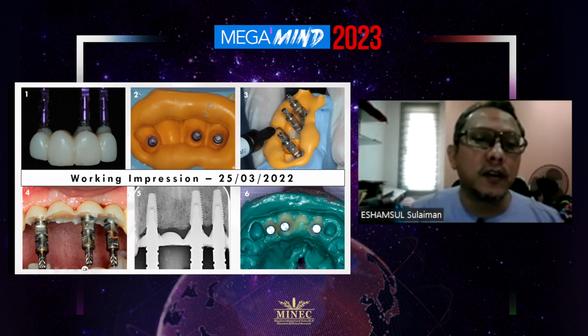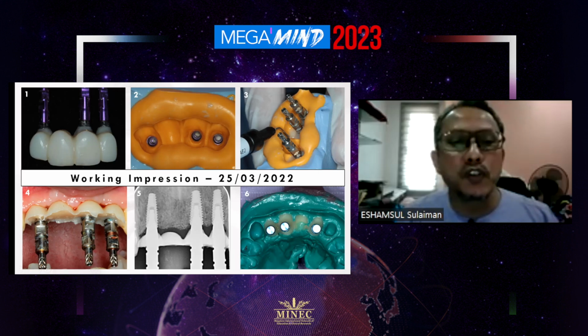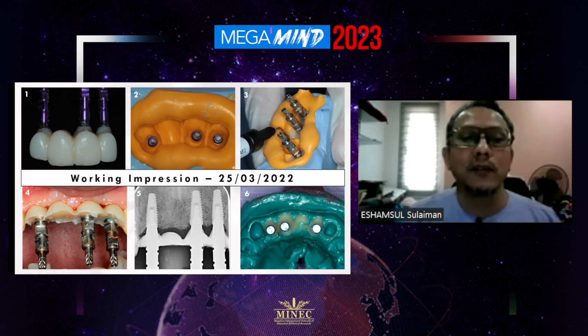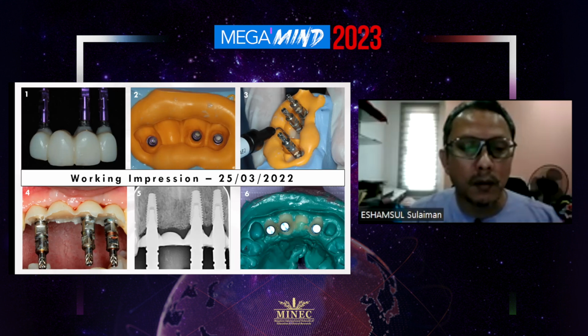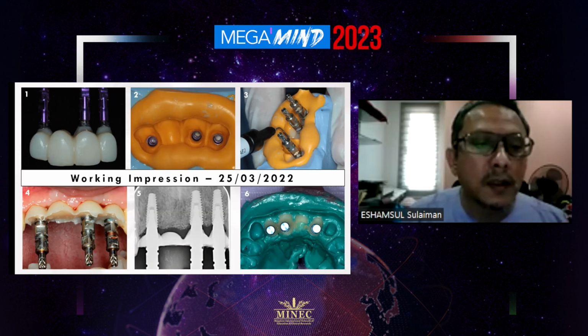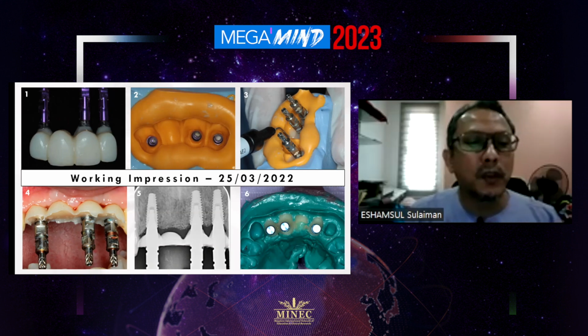And finally, here you can see the assembly of the impression coping as well as the modified composite resin to copy the emergence profile of the peri-implant tissue and the pontic, which were assembled back into the mouth to the implant.